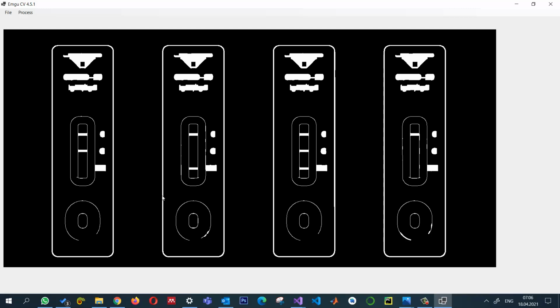Now if I find the contours, this time what I want is not the external contours. When we select the external contour, it will give us these external contours, but I'm not interested in those. I am interested in the contours which don't have any child. For example, this one has no child. I mean, there is no contour inside the contour. So you can see that this is one contour. I just want such contours, and I want to select them. So I'm going to find those contours first and apply some conditions in order to find them.